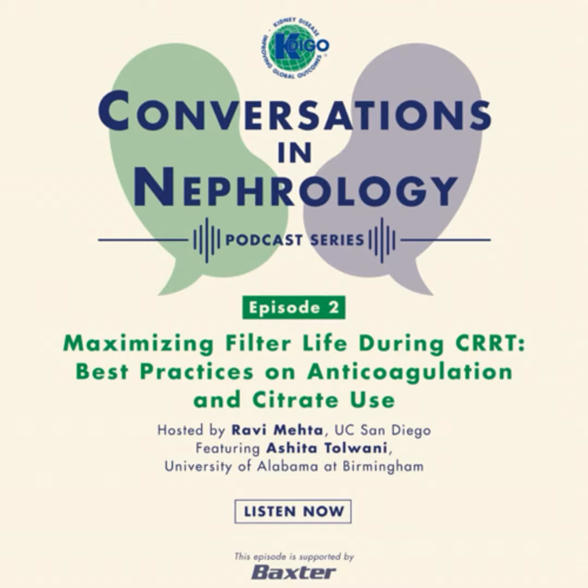needing CRRT. I know, Ashita, you have utilized RCA protocols for citrate safely and effectively for many years. What are the parameters that should be monitored, both for circuit integrity and how frequently should these be done to assure the best performance? Okay. Well, first of all, I want to say that RCA is available for all CRRT modalities. And even if the patient is systemically anticoagulated, you should still use RCA because you want complete control of the circuit. You don't know what's going to happen with the systemic anticoagulation, when it's going to be stopped, et cetera. So we use it even in patients who are systemically anticoagulated.